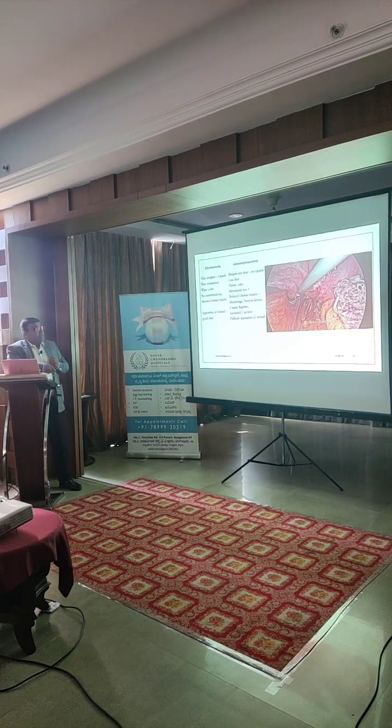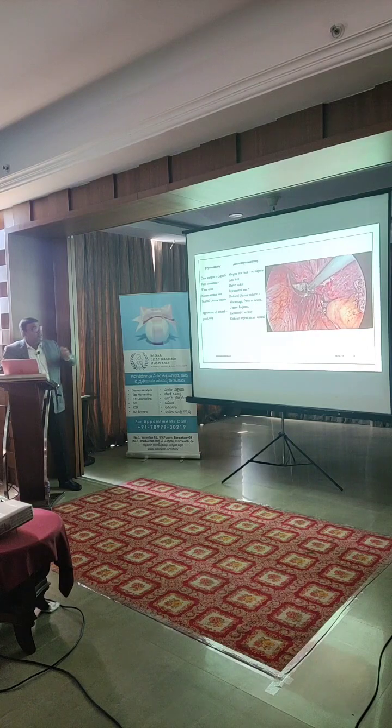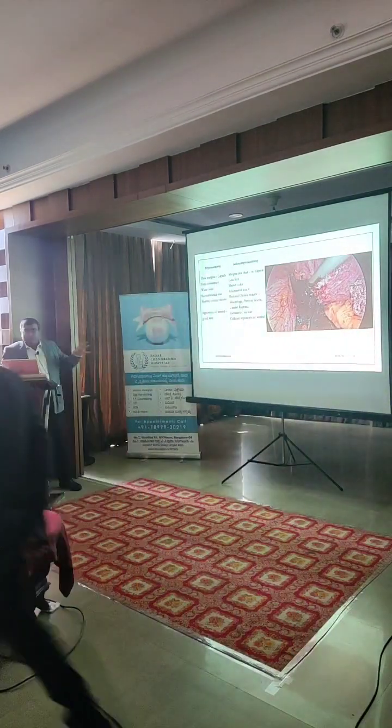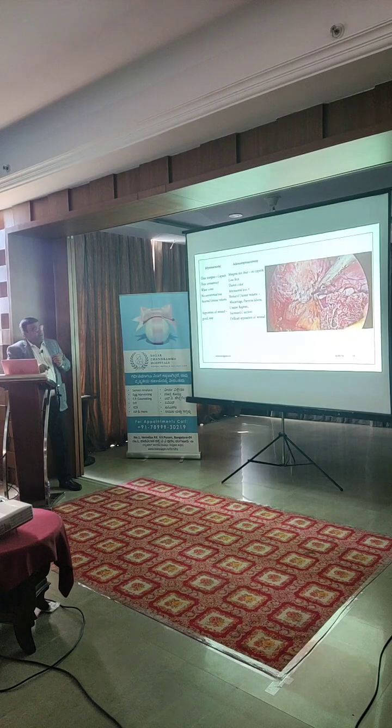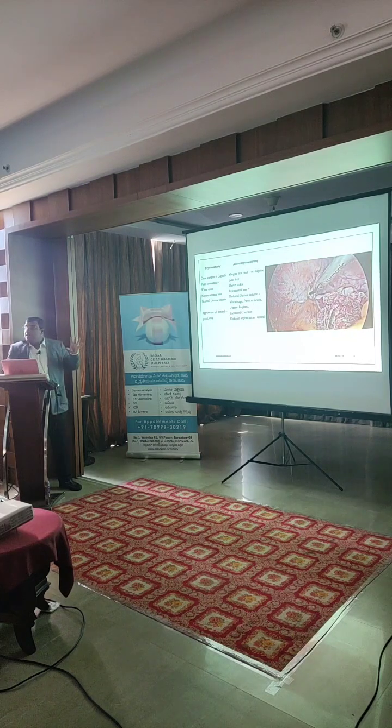Again, the same principle: we have released the ureter, and then the ovary which is stuck there is now also released. The ovary had a chocolate cyst, which was evacuated, and then the ovary was free. The most important aspect for this woman is how can we improve her fertility, if at all.